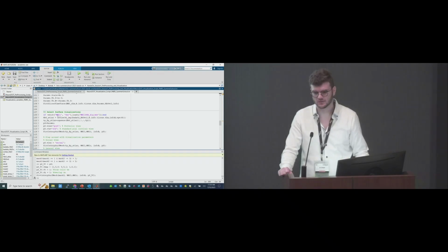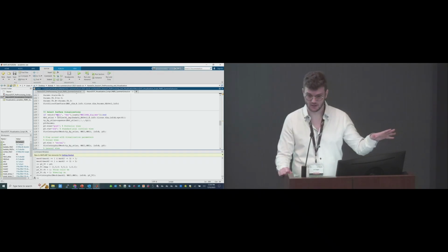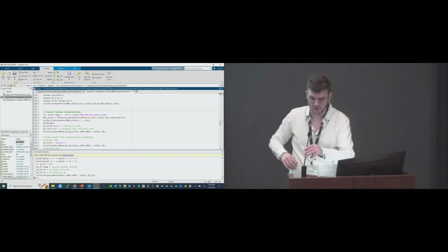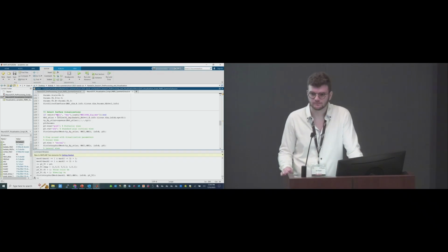In terms of image reconstruction, you start with your measurement level data, and then you also have a model, and your model is built in some space. That gives you data with your model in that same space. And from there, once you're in the space of your anatomy, that's where you can transform to other spaces. We primarily make stuff either in participant-specific or in MNI space, and then we'll transform between the two for group analyses. Okay, perfect. Thank you. No problem.